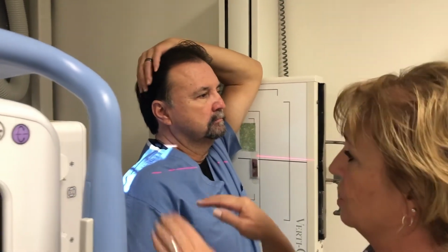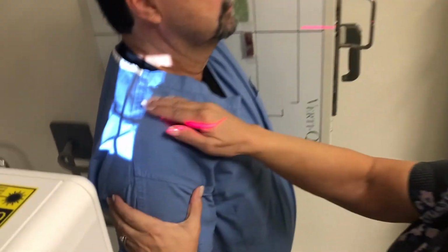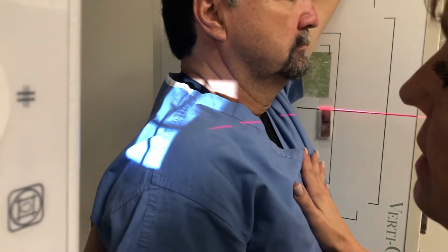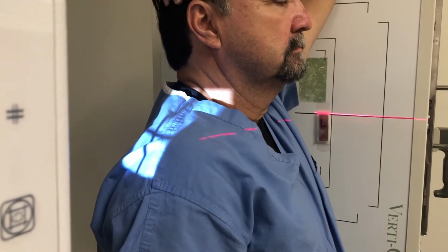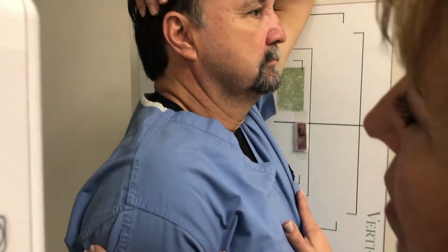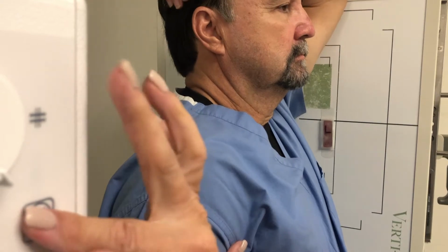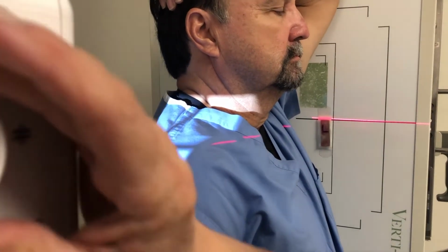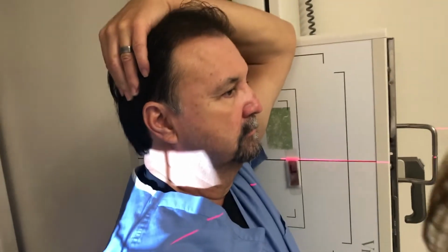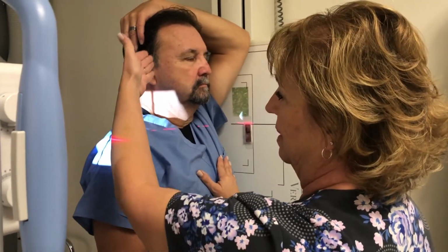So I'm pretty much coming in, skimming the top of this shoulder, still on mid-coronal plane, and my collimation can still be 8 by 10, but because I came into 40 inches, it looks a lot smaller. Okay. The book talks about tight collimation on this, but doctors like to be able to count down.